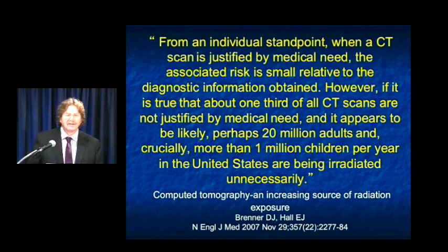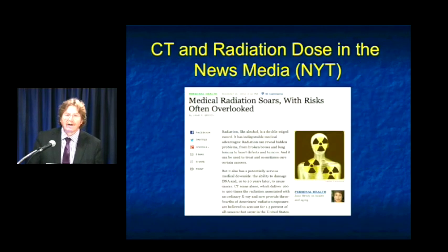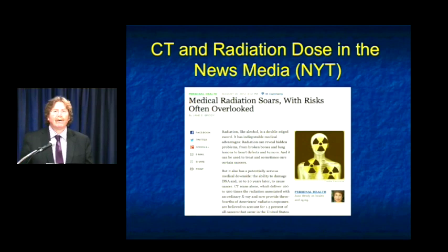And vendors, ever since that time, have put a great focus on developing new scanners with new technology for lowering dose. Now, no matter how low the dose goes, it's never going to satisfy people. It's always going to be something we're going to deal with in radiology. You remember the issues with the airport X-ray machines, where if you went through that 1 million times, it was the same as flying to California, perhaps, or less. But nevertheless, people are never willing to say anything above 0 is satisfactory. And so you're always going to see articles, and it's always interesting to me how articles come out.